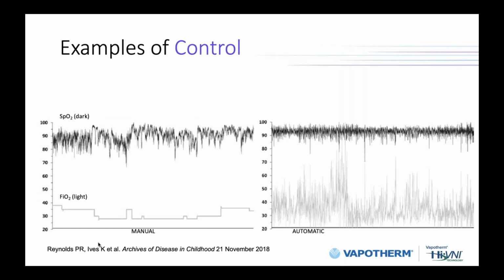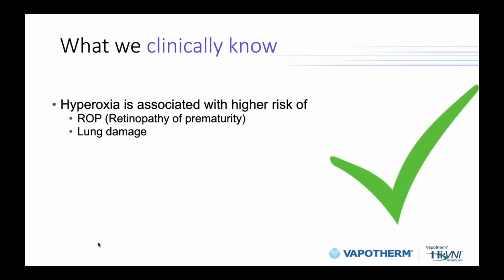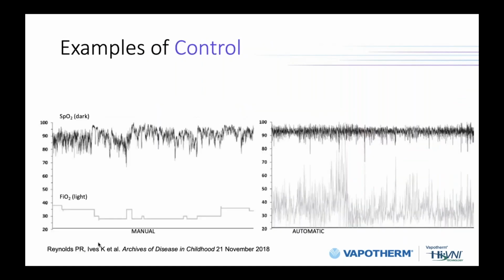And the price you pay for it is basically the extreme high activity of the FiO2 controller. You see that the SpO2 noise is reduced by tremendously increasing the noise on the FiO2 curve. So the controller completely runs crazy, increases, decreases, increases, decreases FiO2 all the time. And this basically stabilizes the SpO2 to allow the babies to spend more time in target range. And you will see many more, much more realistic displays of graphs like this in Kevin's presentation in a couple of minutes.